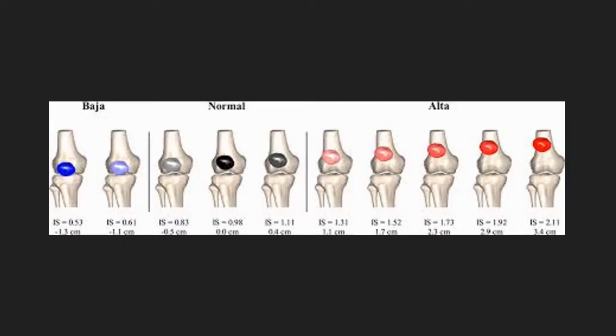So here is a pictorial representation of various positioning alignments of the patella, with the ideal or perfect patella with an Insall-Salvati ratio of 1 being depicted here in this diagram, with increasing patella baja in this direction, meaning increasingly shorter patellar tendon lengths, and increasing patella alta in this direction, meaning increasing length of the patellar tendon. I'm sorry if I said increasing tendon length in this direction. The tendon length actually decreases in patella baja.